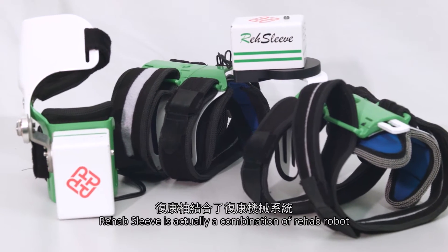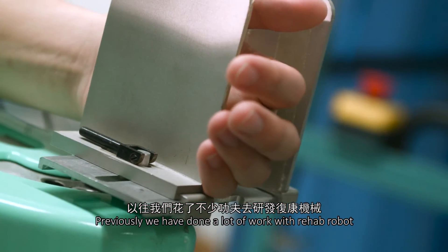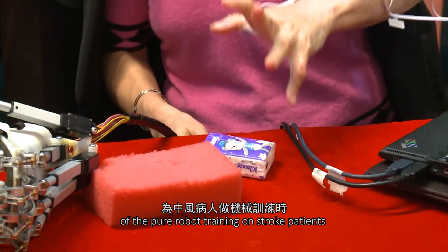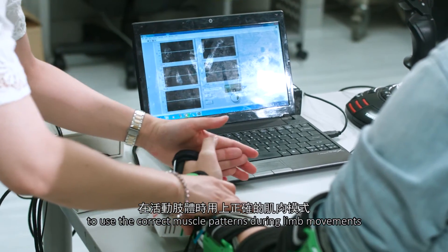The Rehabilitation Sleeve is actually a combination of a Rehabilitation Robot and Functional Electrical Stimulation, called FES. Previously we have done a lot of work on rehabilitation robots, but according to our experience, pure robot training on stroke patients has a key difficulty: how to teach the patient to use the correct muscle patterns during limb movement.